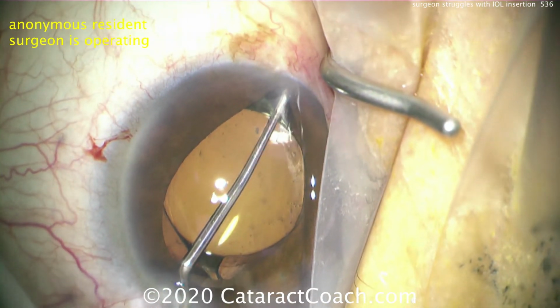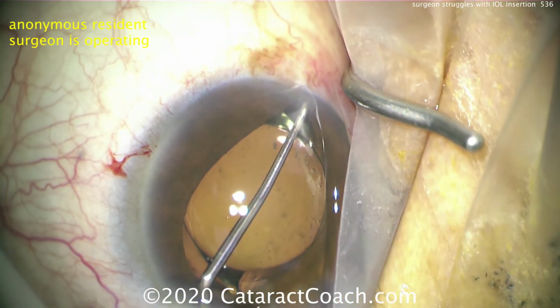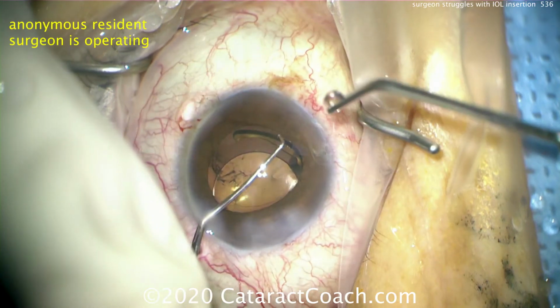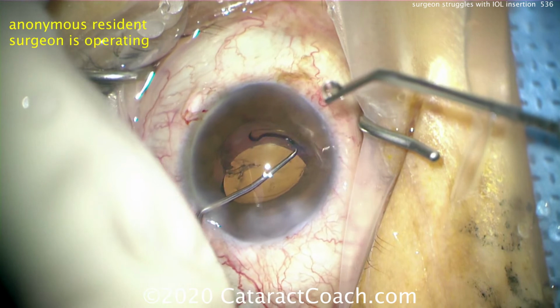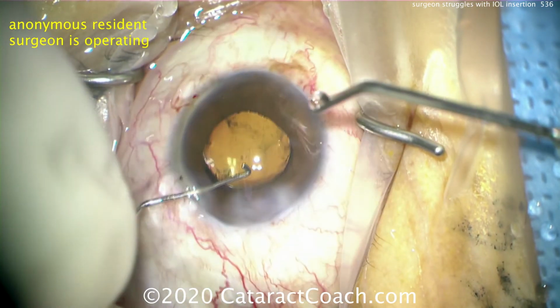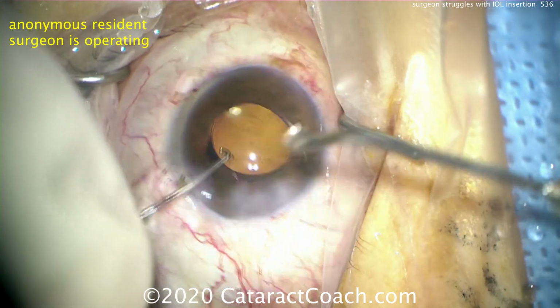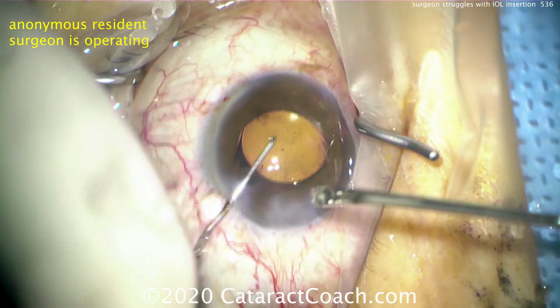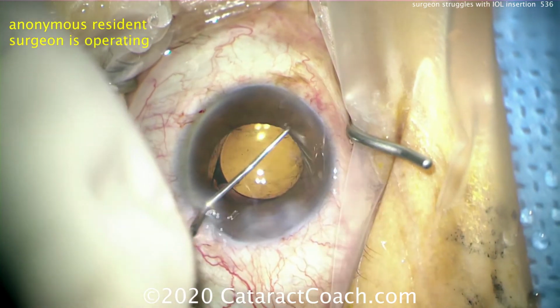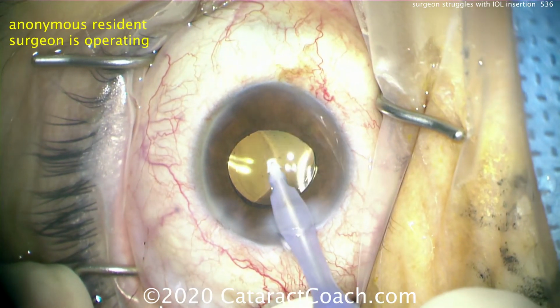Look at the picture here. You can see that leading haptic is definitely just under the iris in the sulcus. The trailing haptic now, there's a good overlap of the rhexis. So now let's get the whole thing placed in the capsular bag appropriately. So this is a lot of struggling. Finally, the lens is in a good position. Finally, the resident can take out the viscoelastic and seal it up and call it a day.